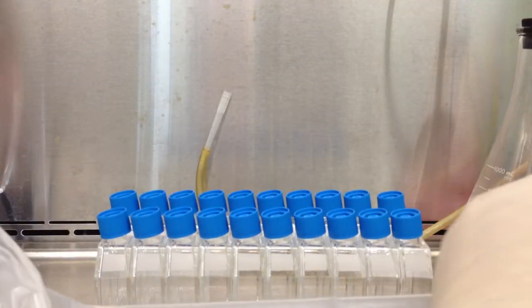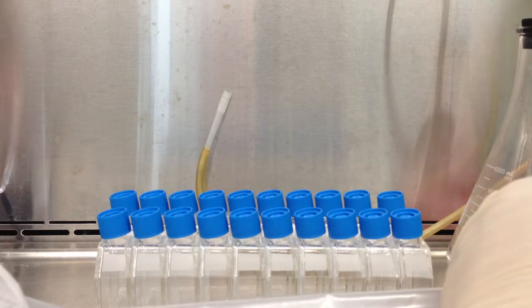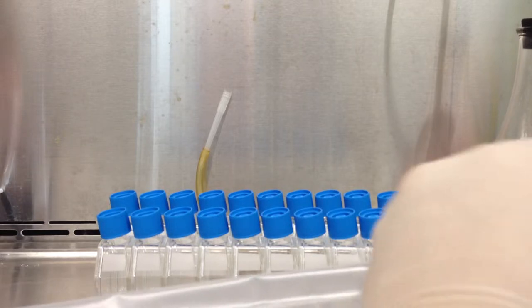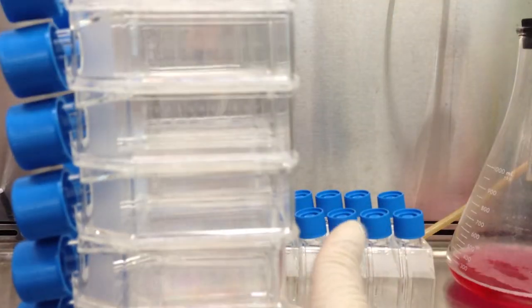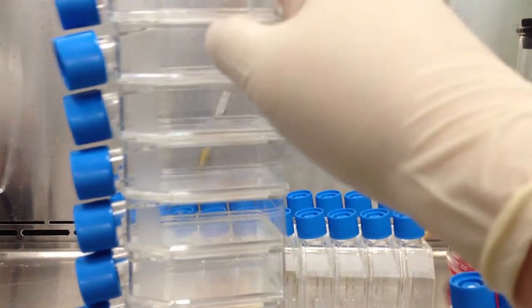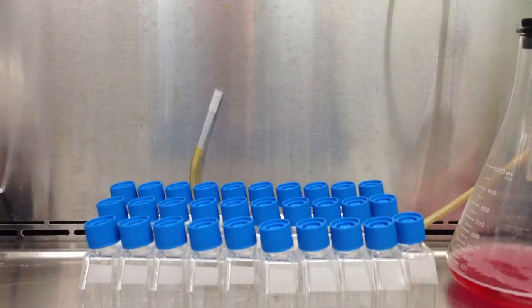About 30 seconds to a minute. Reset the timer real fast. And when I take my T175s out of the incubator, I will hit the sides of the flask to help physically dislodge the cells. And you can hold it up to the light, which you should, and see the layer actually sliding off of the flask. And if it doesn't, just incubate a bit more or hit it a bit harder. Although I'd suggest just incubating for maybe 30 seconds to another minute.